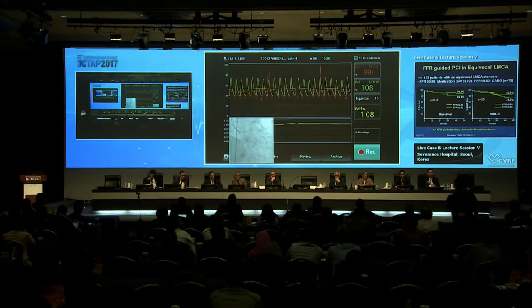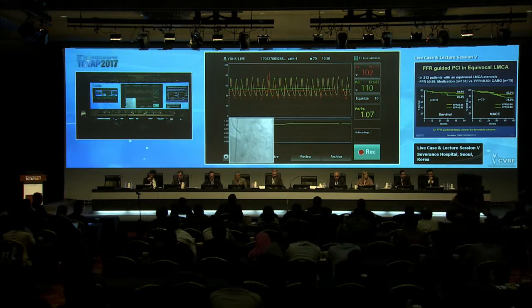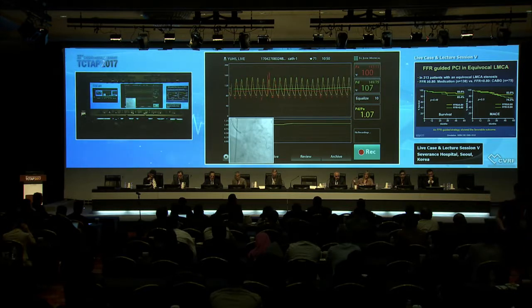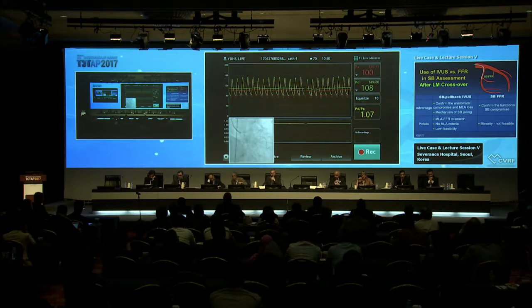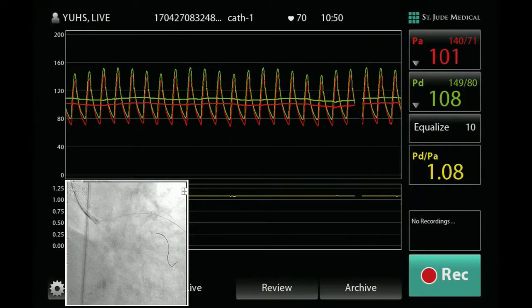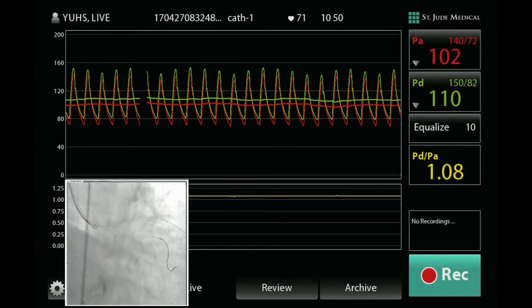So do you want to comment about the curves? Was the adenosine infusion started? So you have an overshooting. Start the infusion. Right now your distal pressure is higher than the proximal. Yeah, probably you need another calibration at the guiding tip and then start.